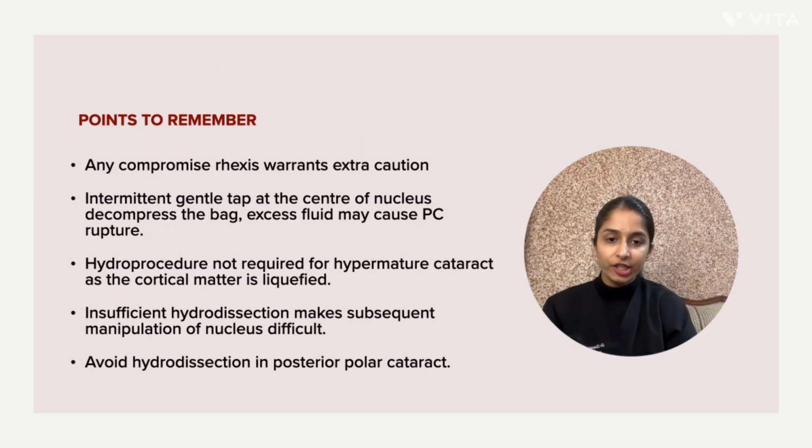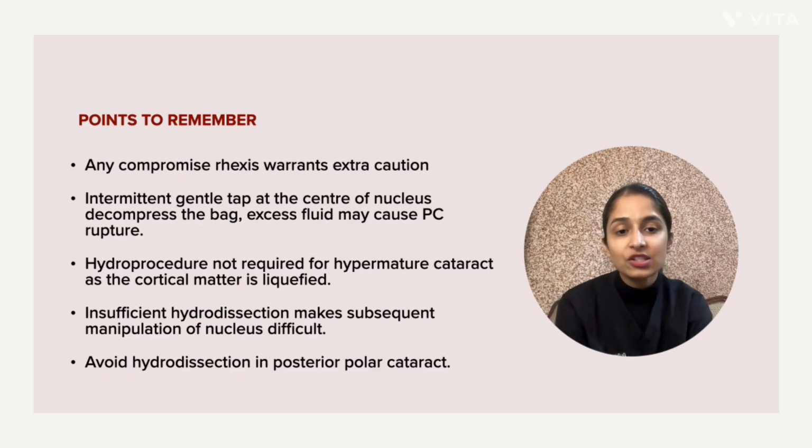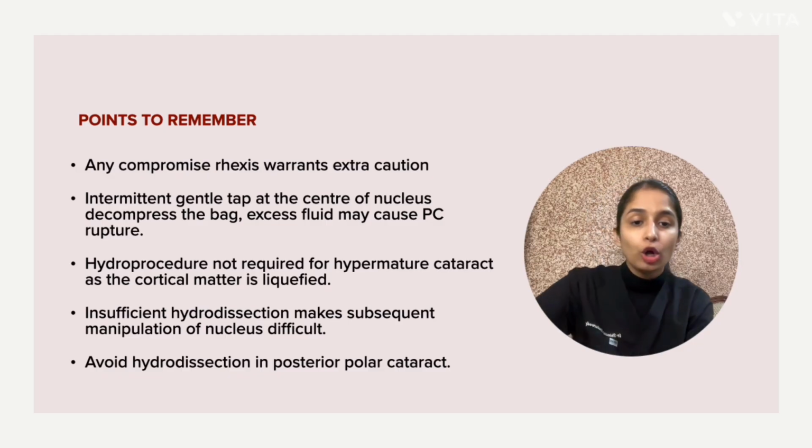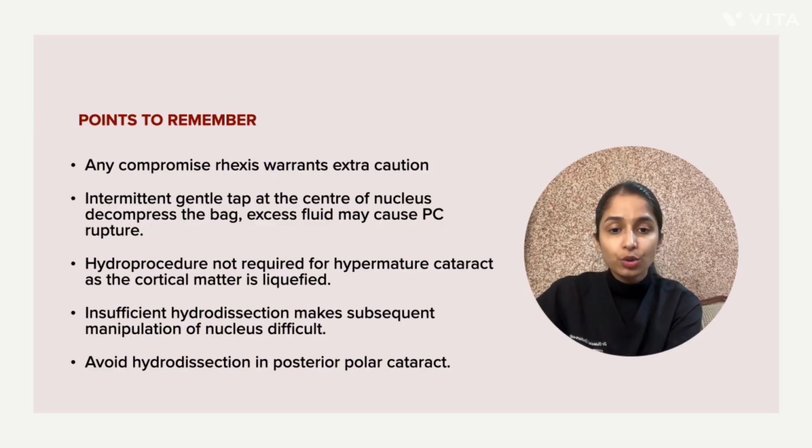Some important points to remember: any compromised rhexis requires extra caution during the further steps. Also, use gentle central tapping during hydrodissection to decompress the capsular bag and prevent posterior capsule rupture. Also, hydro procedures are not needed in hypermature cataract due to liquefied cortex.